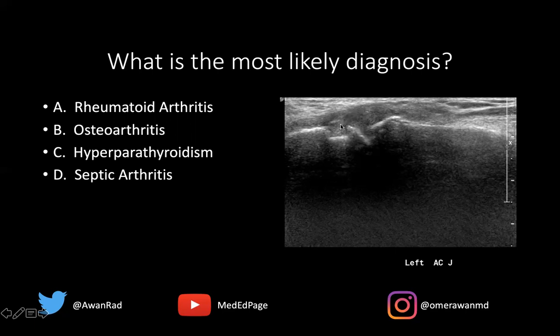We also have capsular hypertrophy. All this hypoechoic area around the joint capsule is hypertrophy of the AC joint capsule. So the best answer in this case would actually be osteoarthritis — this is a case of typical classic osteoarthritis in the acromioclavicular joint.